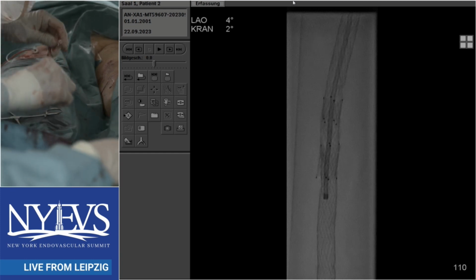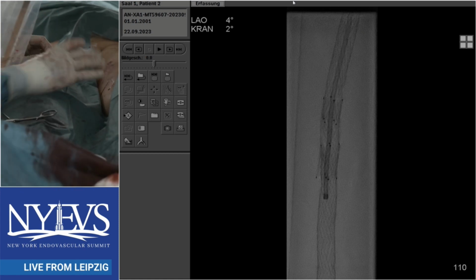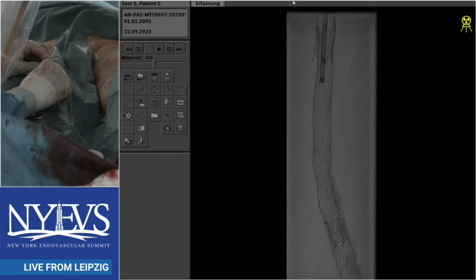Here's an unpopular question, but I know we're in the advent of DVA, and I do a decent amount. Do you think the biggest issue with this patient, with the failed bypasses and endo, is no good outflow? Is there a role for that in the future? If he develops rest pain, would that be a potential option?